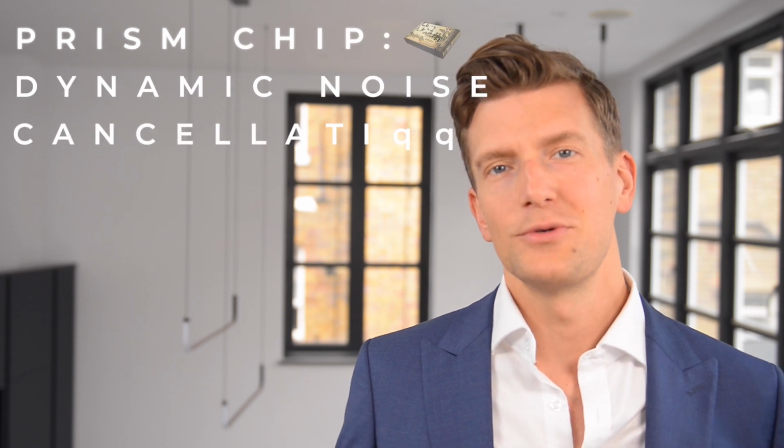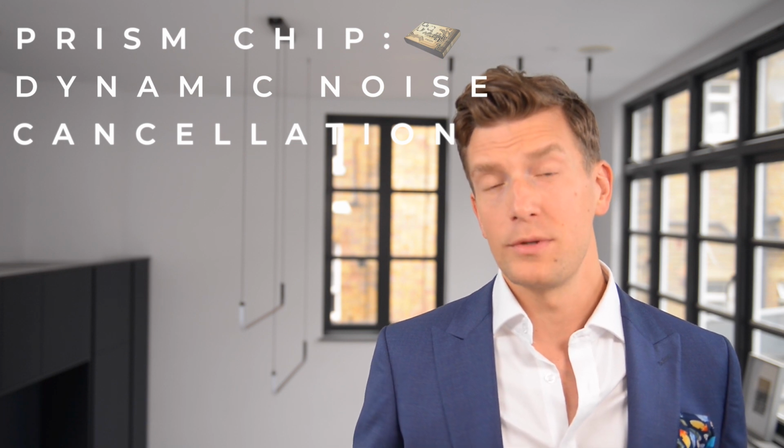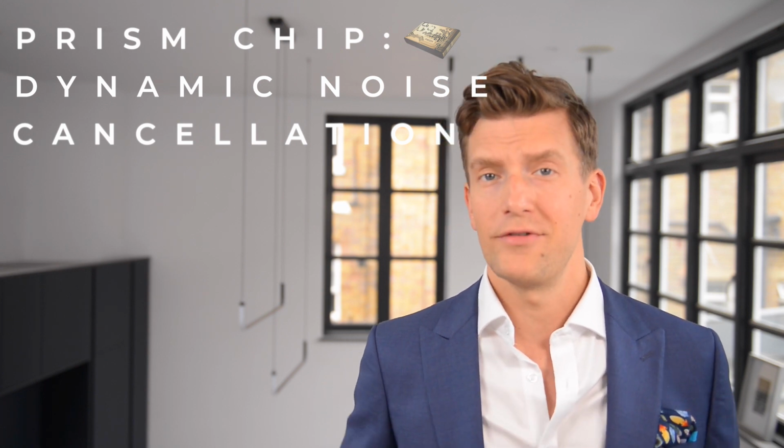And finally, dynamic noise cancellation is a spatial noise cancellation feature that works in combination with a directional beamformer to improve the speech to noise ratio in those more complicated listening environments such as restaurants, groups or crowded environments.